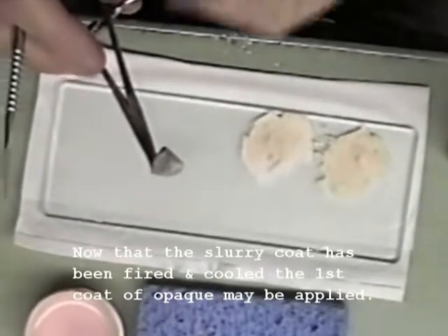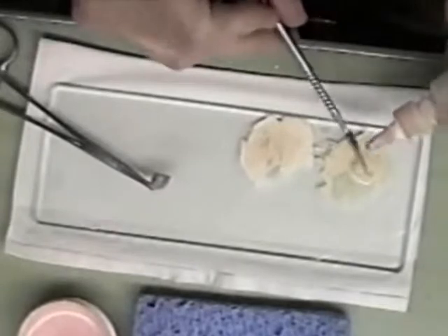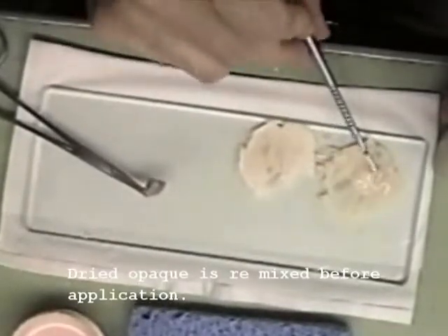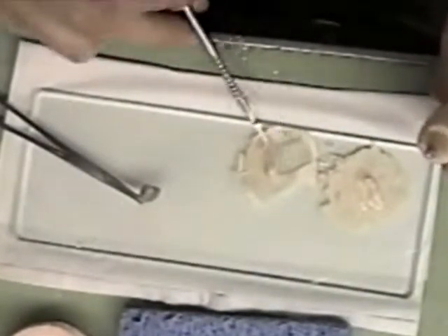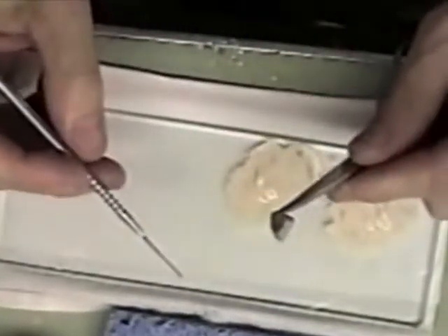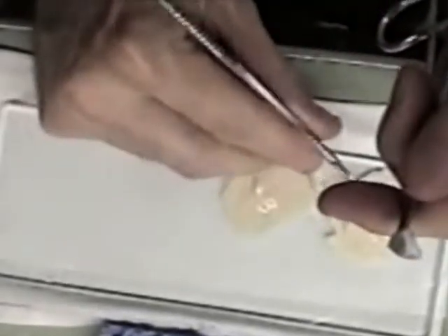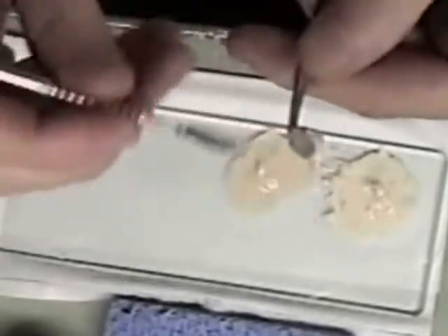Now I'm going to apply my first coat of opaque. I'm going to re-wet the opaque. I use an instrument to apply this first coat of opaque. Let's dry it out.